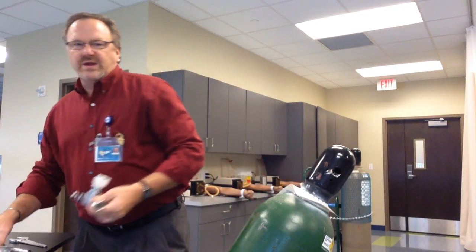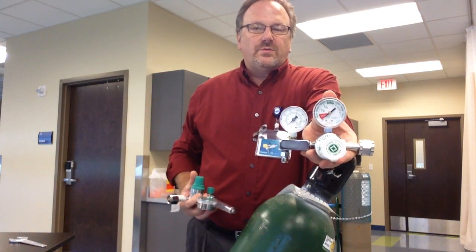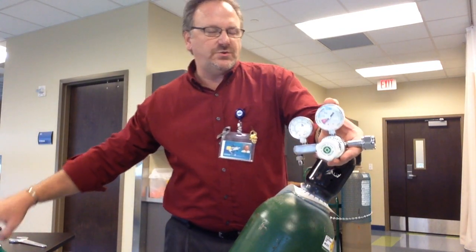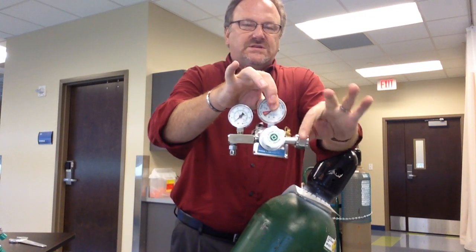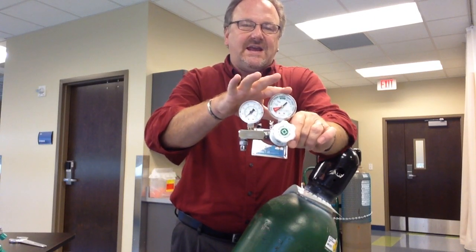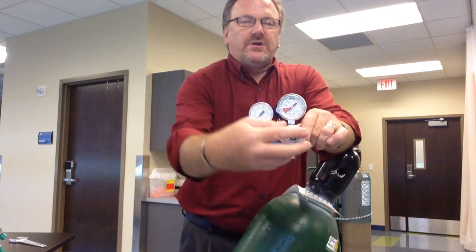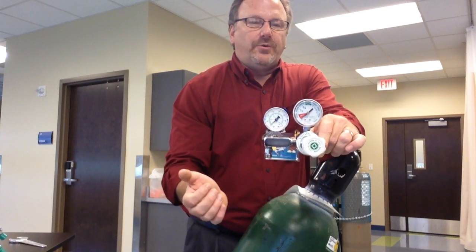You'll also need a regulator. Depending on what you're doing with the oxygen tank, you'll either need a pressure regulator or one with a Thorpe tube. The pressure regulator has two gauges on it — these are called Bourdon gauges. The first gauge, since it's closest to the tank, tells you the pressure inside the tank. The other one tells you the pressure outside of the tank — your delivering pressure. This adjusts the output pressure.